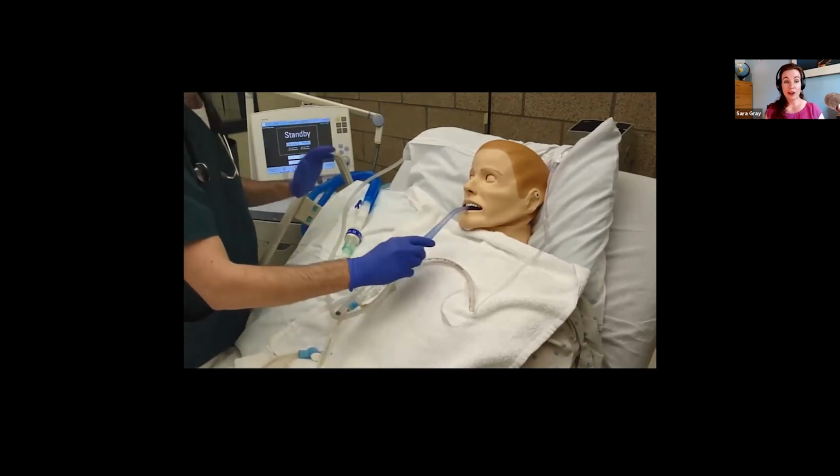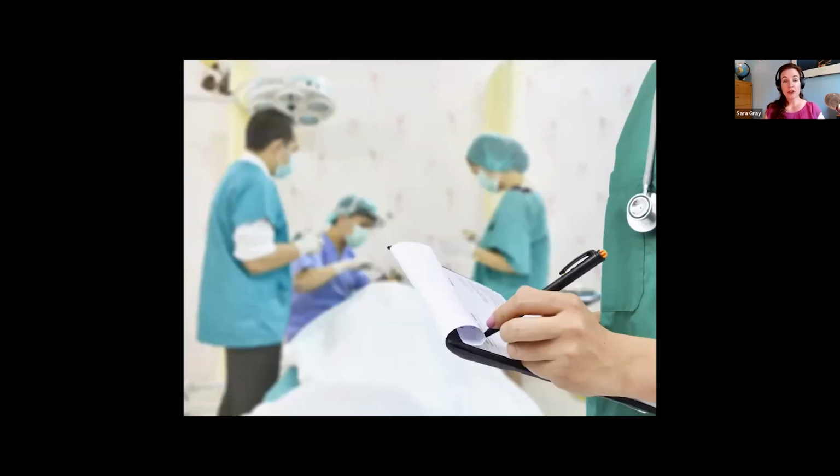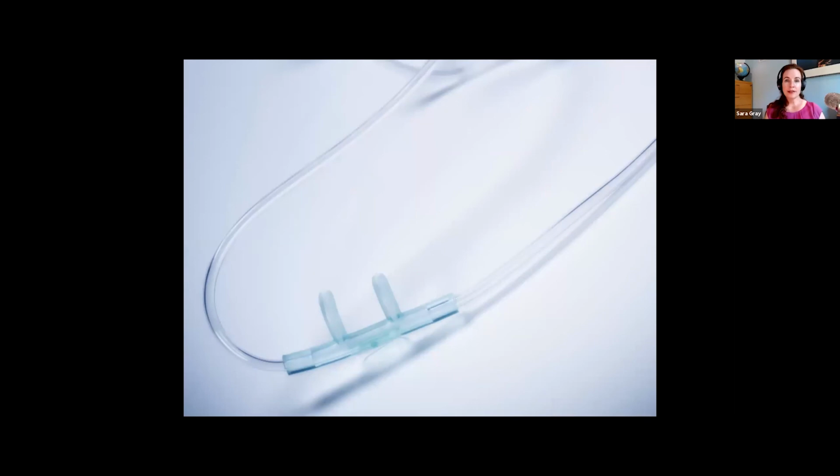Your vent will alarm there, so you can see he puts it on standby. That's a smart idea so the alarm doesn't bug you. And then you're just putting them on some oxygen, a face mask or some nasal prongs. And at this stage, you're checking in with the patient because you're looking for one of three options here. In the best case scenario, your patient is happy, they're breathing well, they don't need a lot of oxygen, and you're now going to monitor them for an hour or two, and then you're going to disposition them.